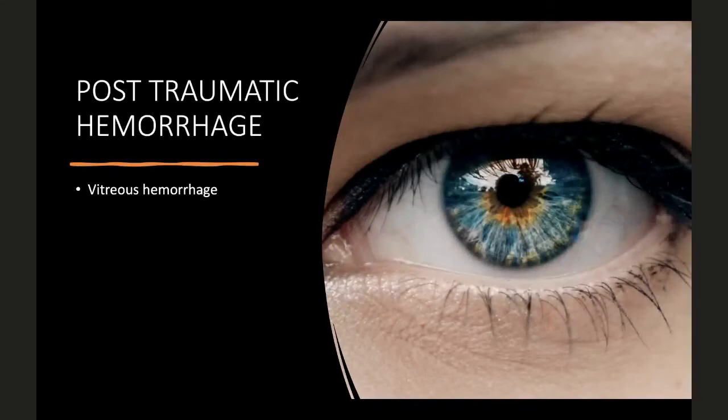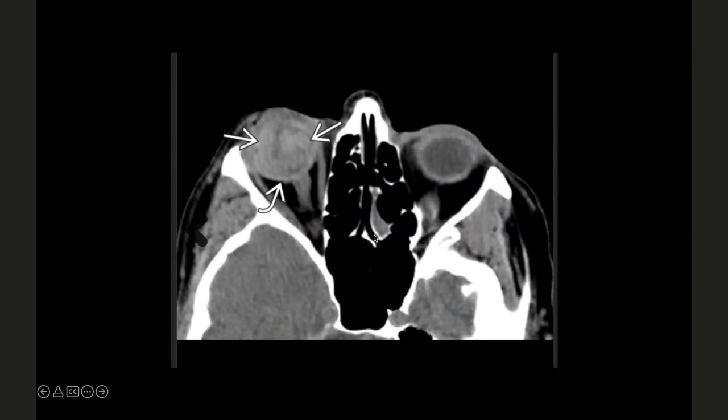So when it comes to hemorrhage, I gave the diagnosis first, then I'm going to go into the anatomy, unlike how I do in my brain, because I just want us to be clear what we're seeing next. So this is a case of a post-traumatic hemorrhage, and it involves the vitreous, and we're going to walk through it together, because now we know the globe. And how come one globe is bigger than the other globe? Well, is the head a little tilted is what I want to know first. I don't think so, because the sinuses look all right, and I can see the carotids, and I can see actually the lateral orbits. Okay, a little bit of the zygomatic arch I am seeing, which means it's a little bit tilted. So when it's tilted, maybe a little bit larger globe on one side is acceptable.